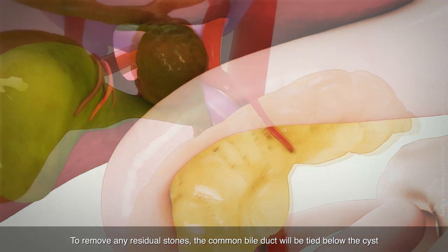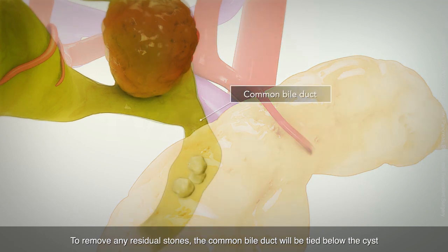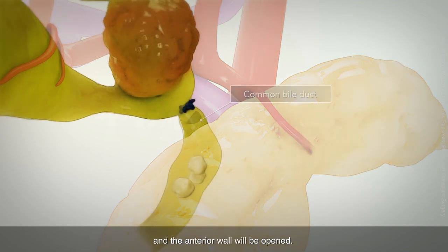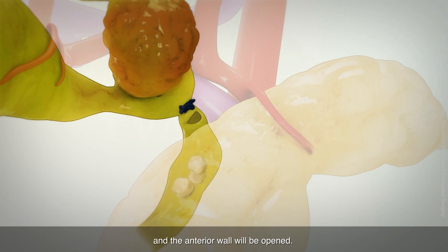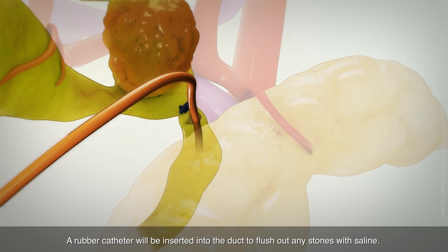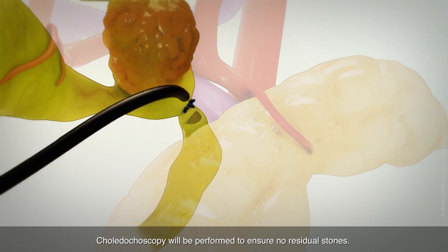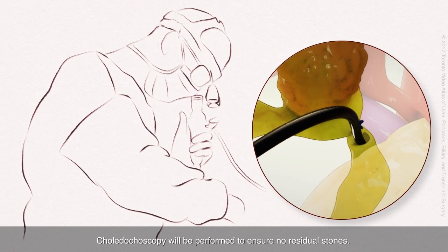To remove any residual stones, the common bile duct will be tied below the cyst and the anterior wall will be opened. A rubber catheter will be inserted into the duct to flush out any stones with saline. Choledochoscopy will be performed to ensure no residual stones remain.